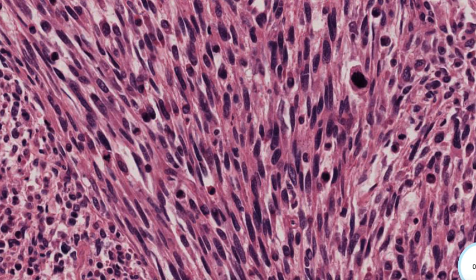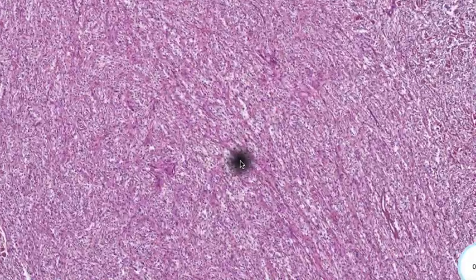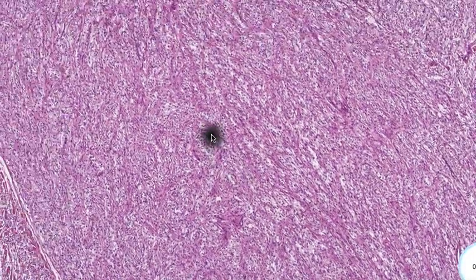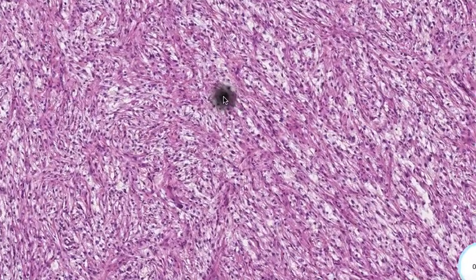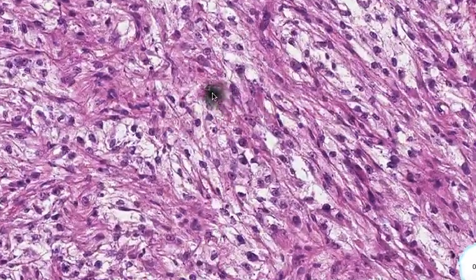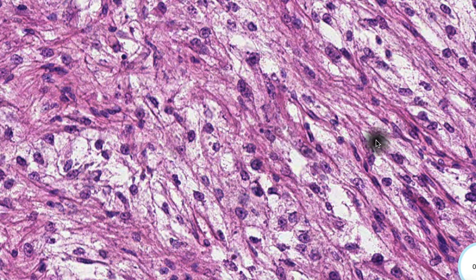Another feature to compare would be that of a PEComa. Here's a high-magnification view of a PEComa, which also has somewhat of a spindle-shaped growth pattern. But the cells are less closely packed, there's more cytoplasm, and it's oftentimes clear. Of course, the immunohistochemistry would be remarkably different, as this would stain with HMB-45 or other markers of PEComa.